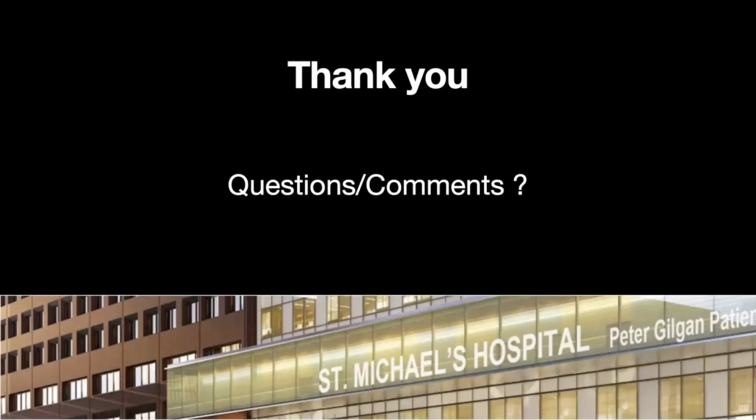I didn't show a very, very calcified valve today in terms of the clips, but certainly some valves can get quite calcified, and it should raise suspicion. Thank you.